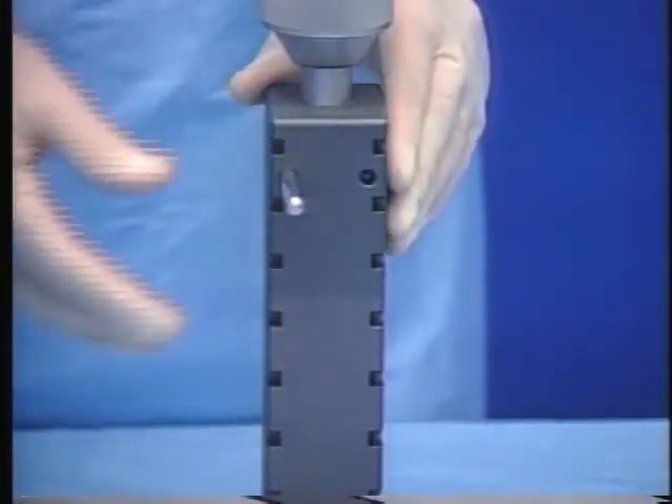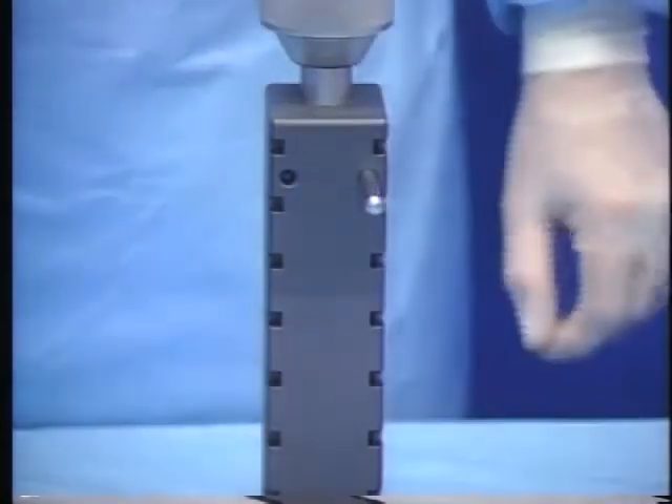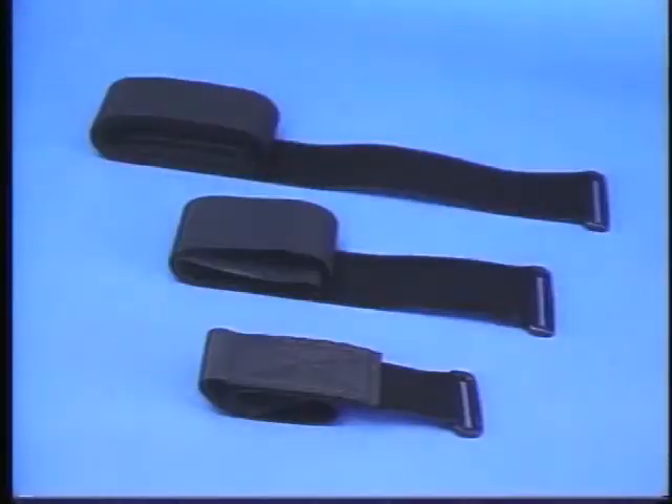Additional components include a radial ulnar deviation pin, which is inserted into one of two locations in the primary support; an x-ray cassette bracket, which also can be attached to the primary support; and three patient positioning straps for wrist, forearm, and upper arm stabilization.